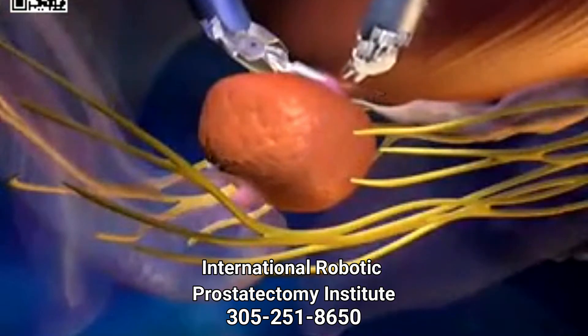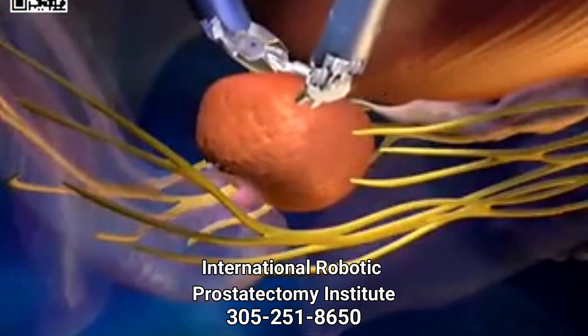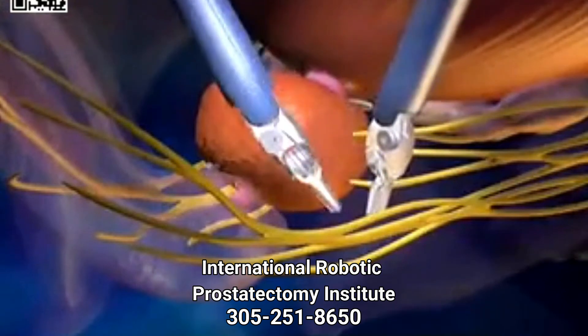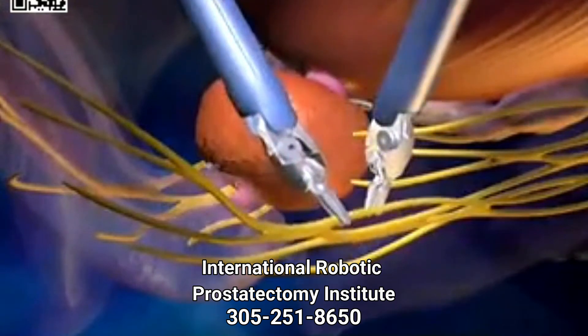This added control and precision may assist the surgeon in preserving the anatomy necessary for urinary continence, as well as the nerve bundles responsible for erections.